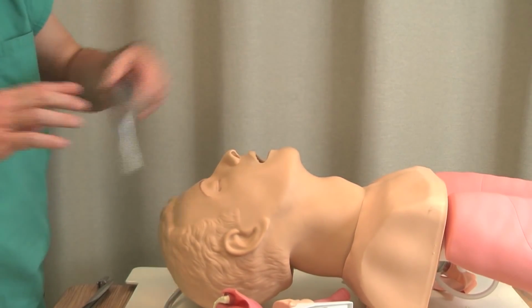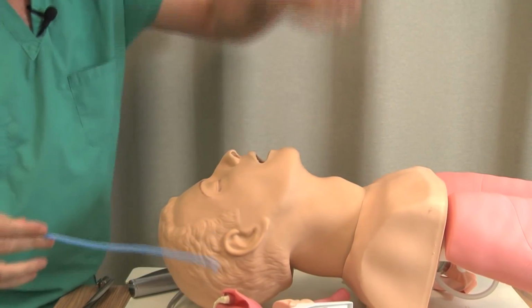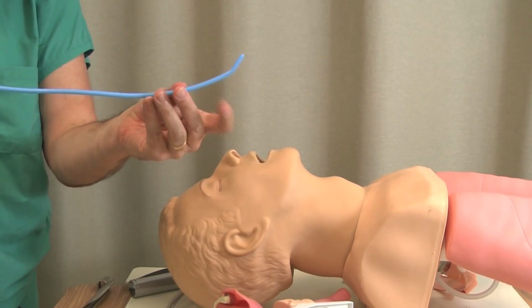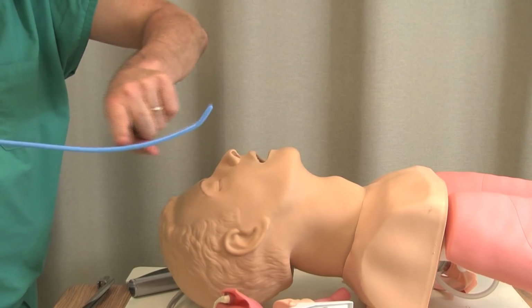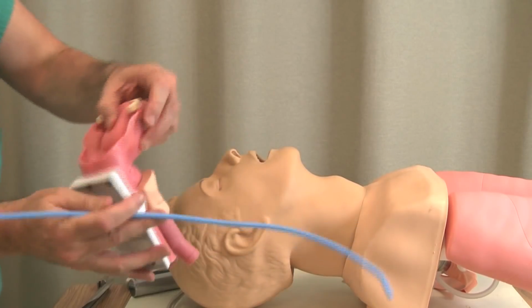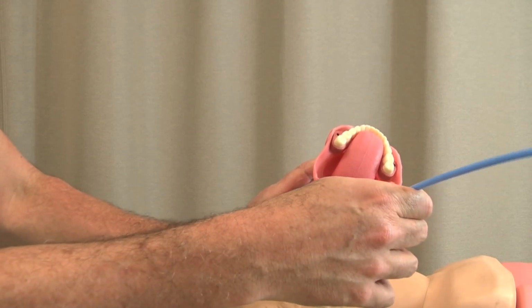And now the final trick that helps a lot of times, and that is use of an intubating bougie. The thing that gets us most often is the fact that the cords are just a little too anterior. We just can't quite make it up there, okay? And that's where the bougie really comes in handy. You see this little tilt up here? It goes like this, and I'm exaggerating, it tilts up. That's what allows you to get the endotracheal tube in. This has really helped us out a lot. If you don't quite have the view, you can put the bougie in and slide underneath. You see how the bougie has now slid between the cords?